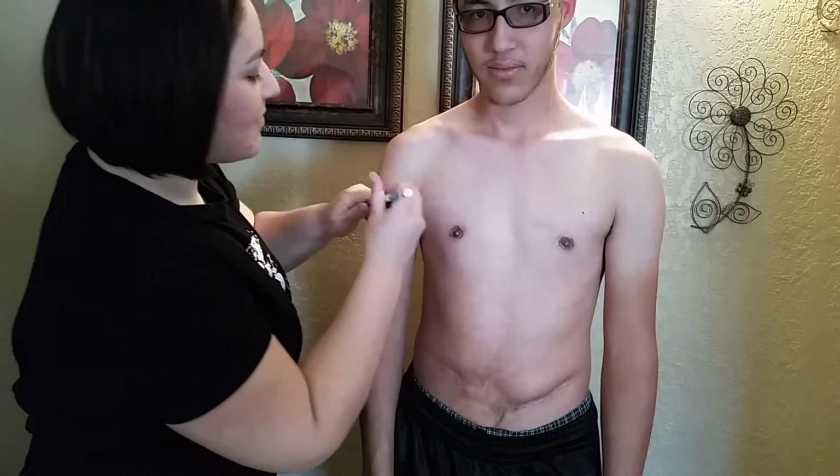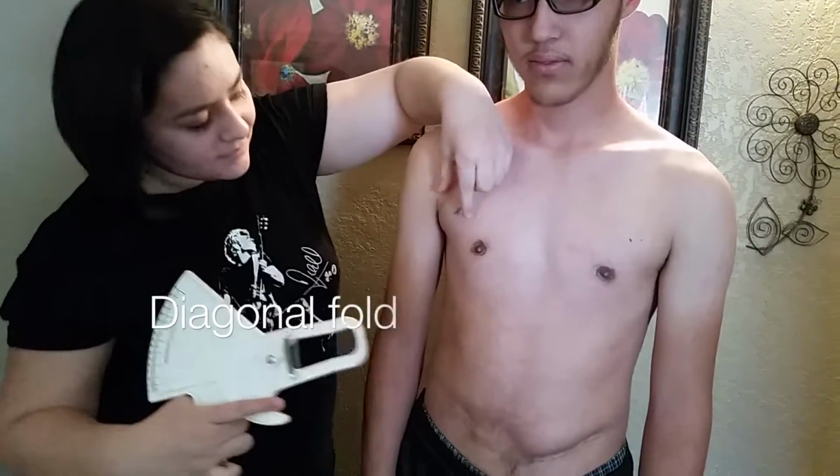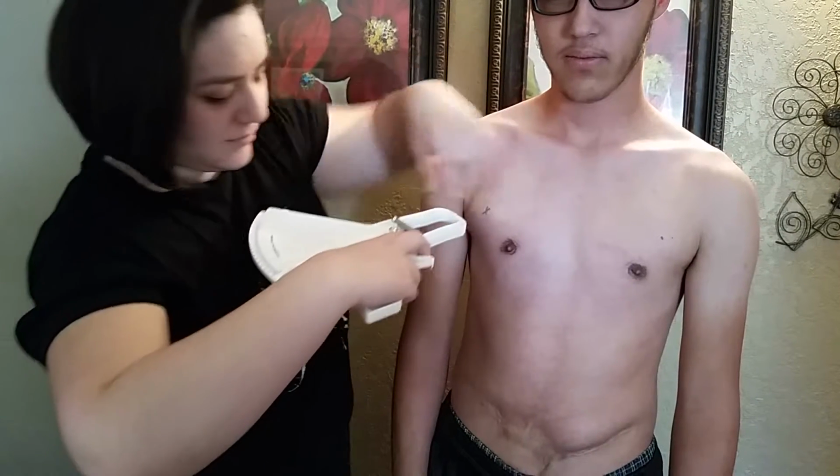Next, for the chest or pectoral site, measure the distance between the anterior axillary line and the nipple. For men, mark your X 1/2 of this distance. For women, mark your X 1/3 of this distance. Obtain a diagonal fold, obtain your reading, and release.